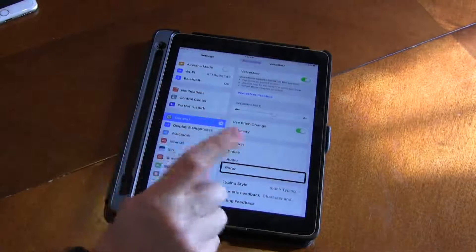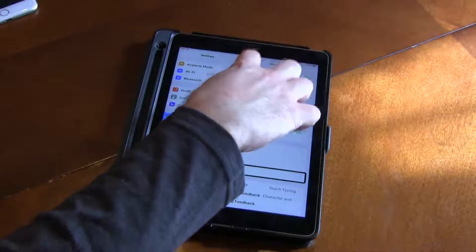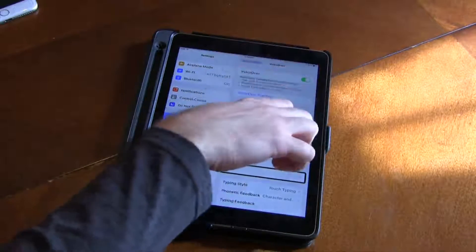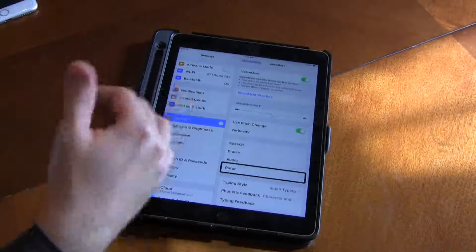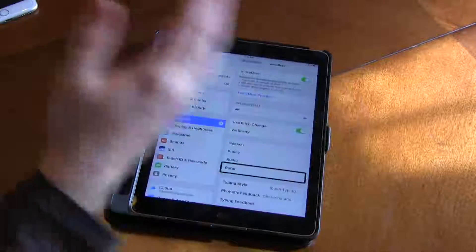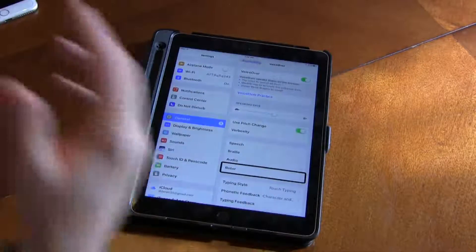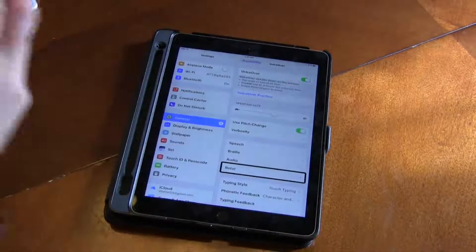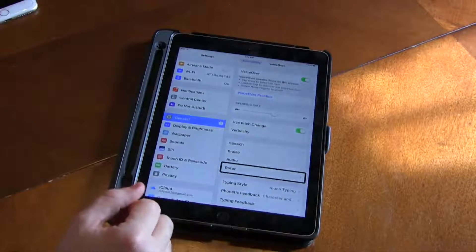Basically, you take your index finger and your thumb and you turn like a dial on the screen. It gives you different options — like Words or Speaking Rate or Language — depending on which way you turn. It's kind of like scrolling through a never-ending list. Say you have five items: you're going to scroll through those five items over and over, so you get that general idea.